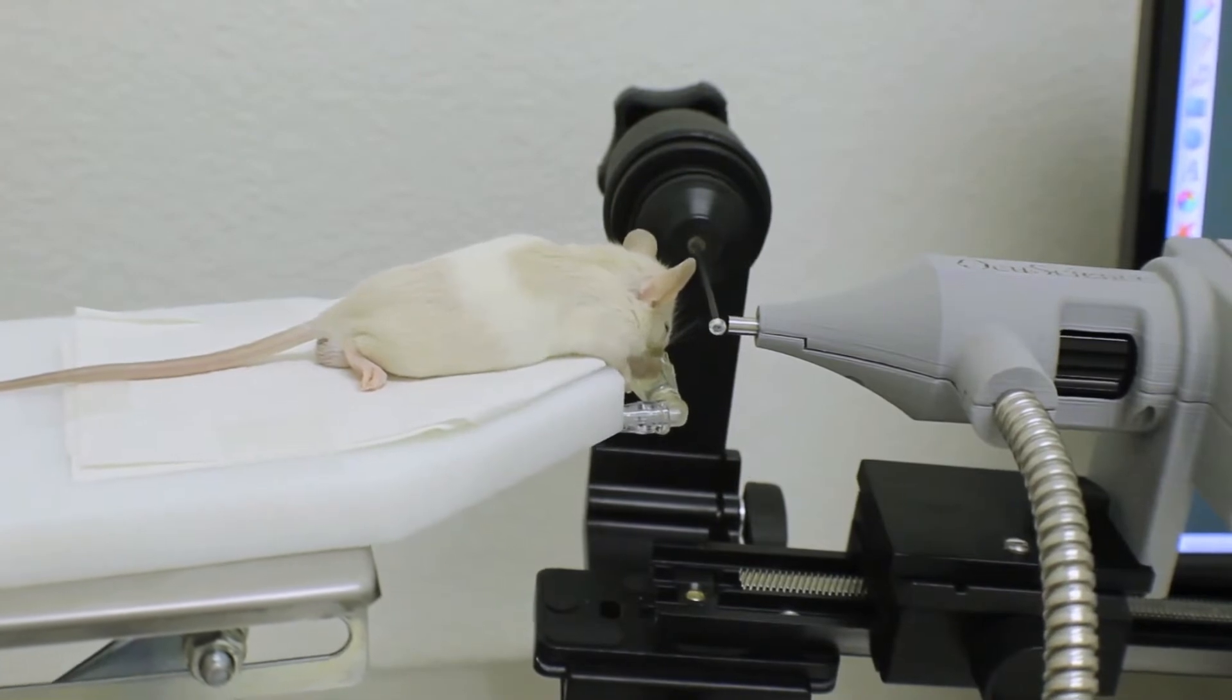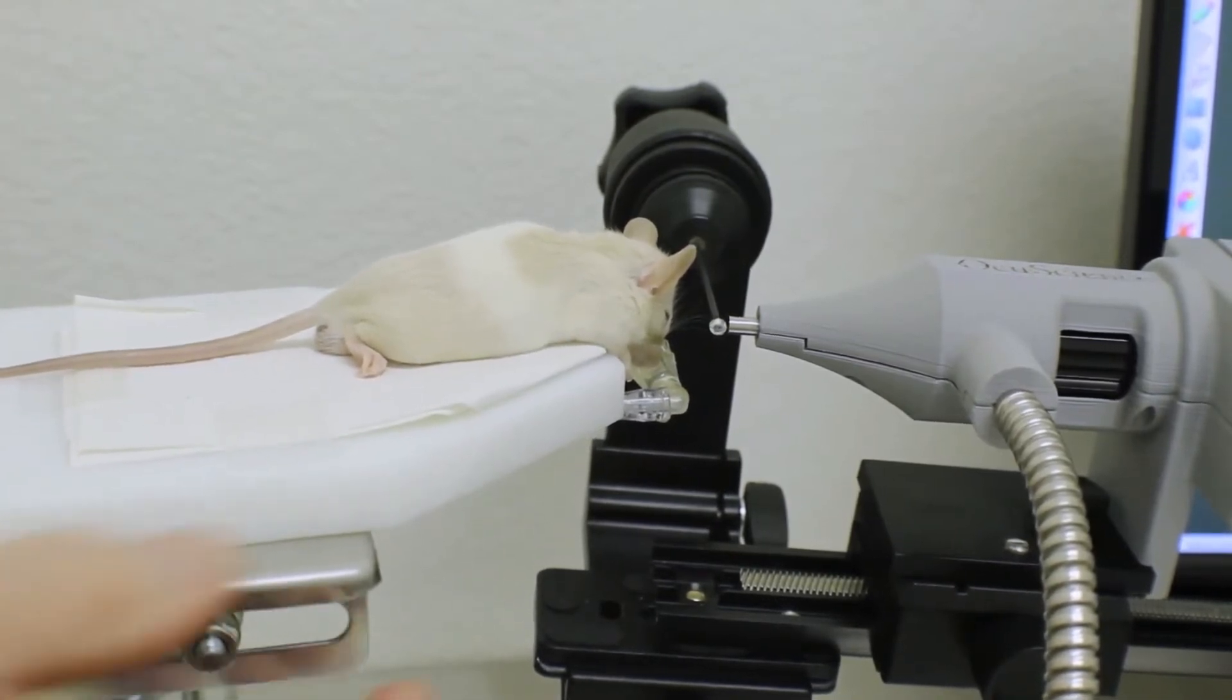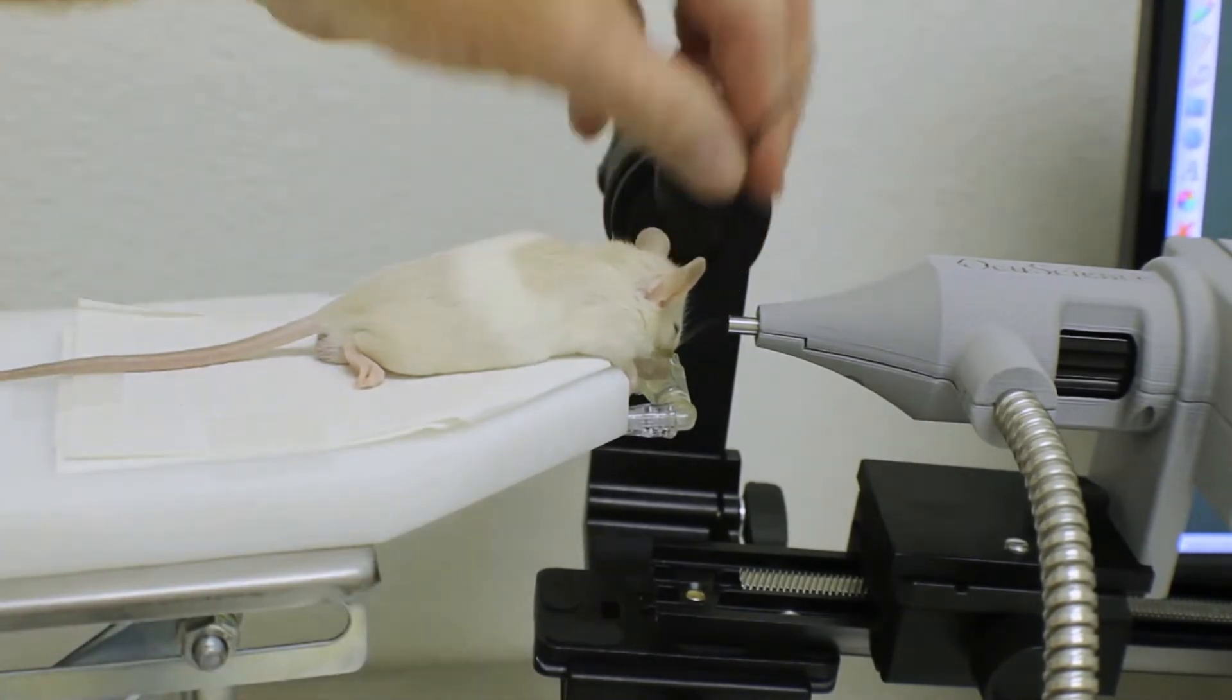Examinations are clear and smooth with our multi-axis gimbal and examination table, which secures the fundascope position at any angle and proximity to the patient's eye.